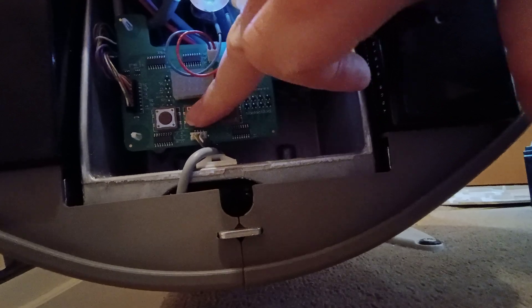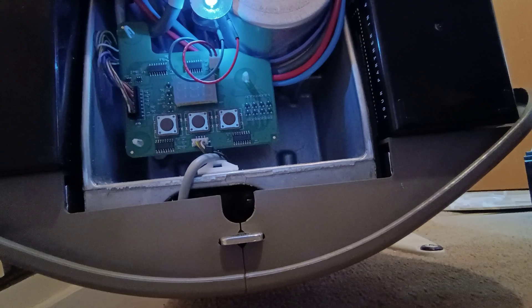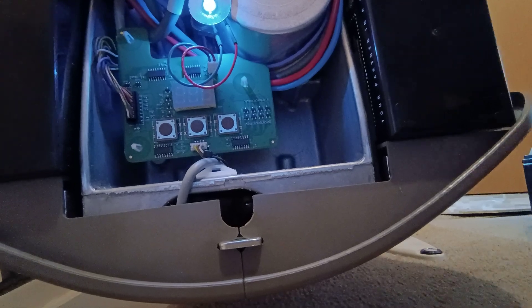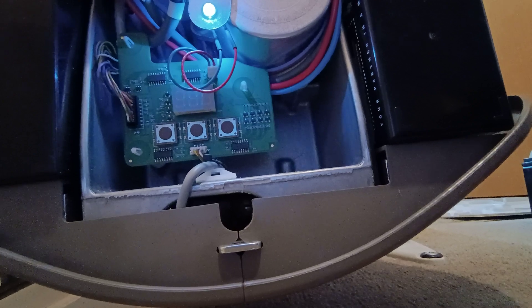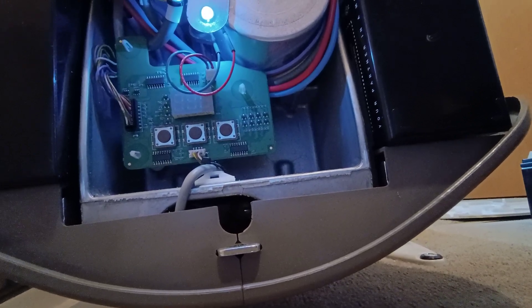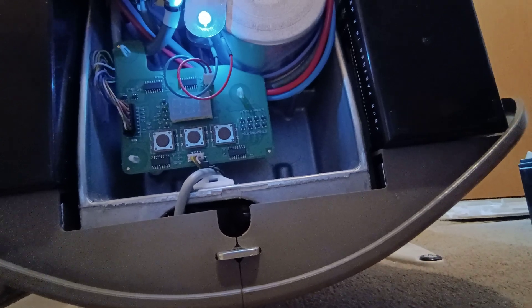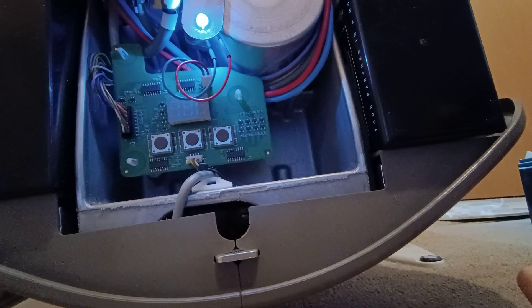Now if you press the middle button you get B14 in this case, which I think is the current software or firmware sitting on the electronics here. Then if you press it again you get a voltage readout - 26.0 volts. You might see 26.1, it might go down into the 25s. This is on a charging point at the moment so 26.1 would be a reasonable level for that.